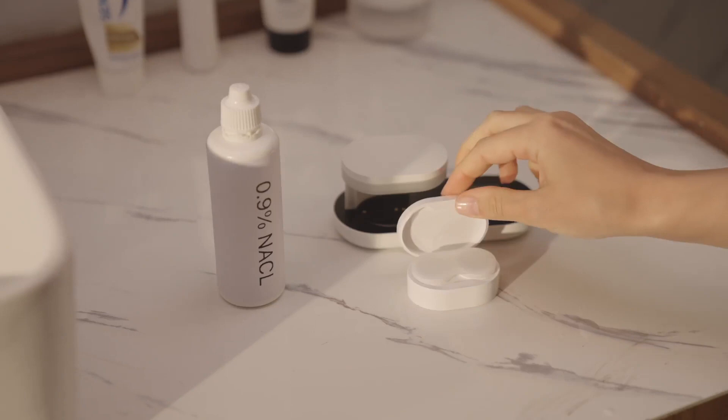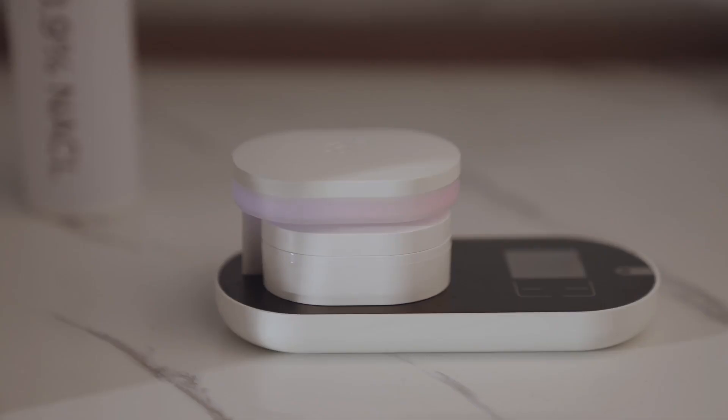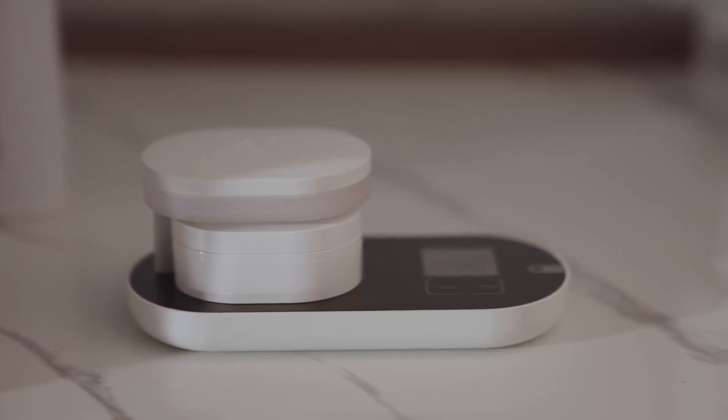ReO2 is incredibly easy to use. Simply put your contact lens in, touch the screen, and you're good. Unlike ultrasonic cleaners, ReO2 has no mechanical vibration, so you don't need to worry about damaging your lenses while using it.